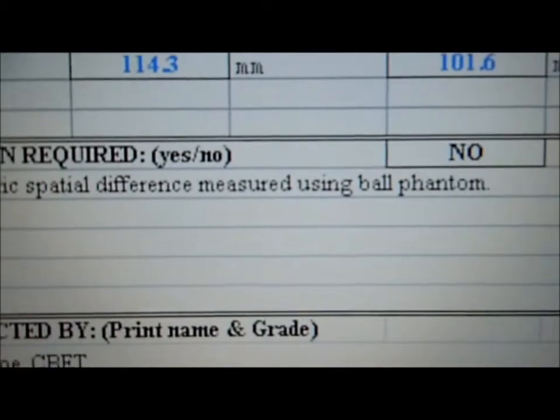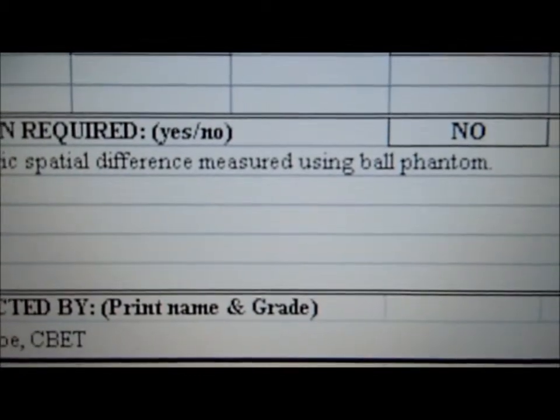Finally, we perform any action required as well as have the technician sign the form.